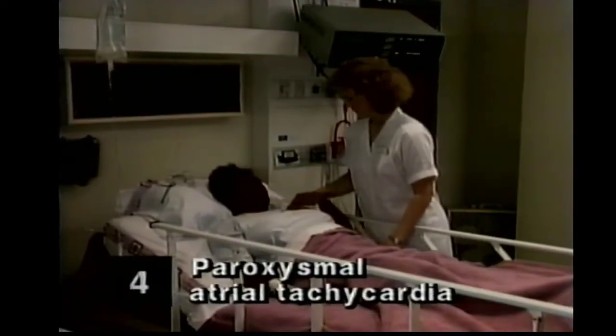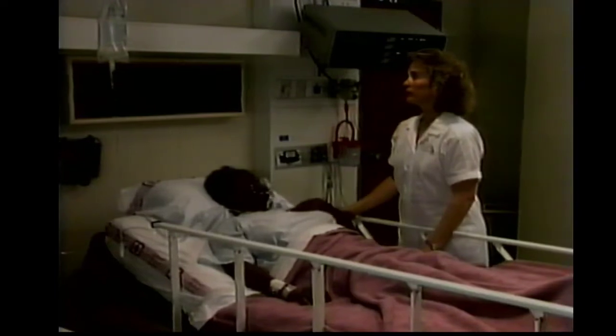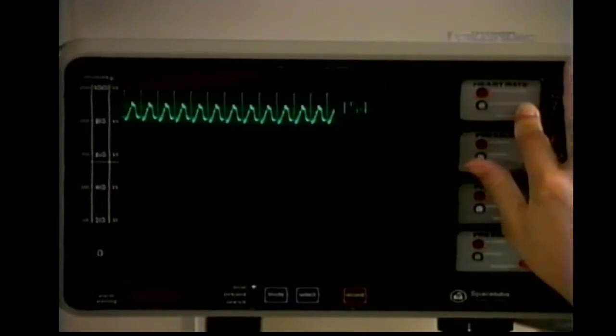This 41-year-old patient has a long history of palpitations and rapid heart rates. On admission to the CCU, she appears to be dyspneic, and her respiratory rate is 28. Her heart rate is 154, and her blood pressure is 110/50. She seems extremely apprehensive, but is not complaining of any pain. A baseline rhythm strip is recorded.